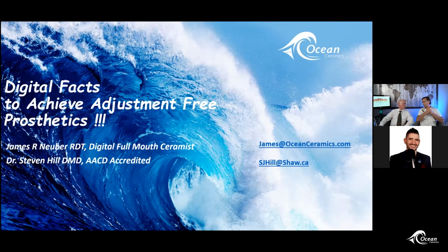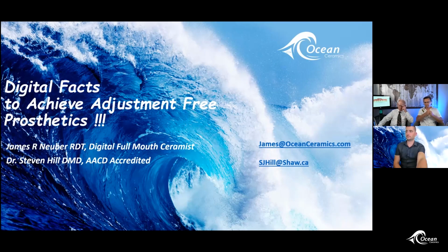Yeah. Well, we've been working with Honigum, and our clients have about 80% of all of our impressions coming in as Honigum. The only material that comes close to the accuracy consistency is Impregum, but Impregum shrinks 0.05%, but it tastes like garbage, and sometimes will pull a tooth out. It's so rigid. It's as hard as rocks. But it's also a fantastic material.